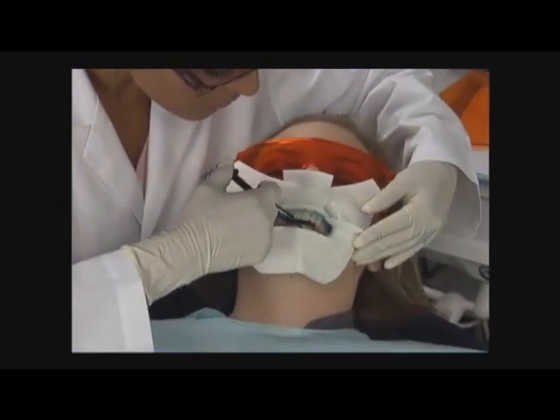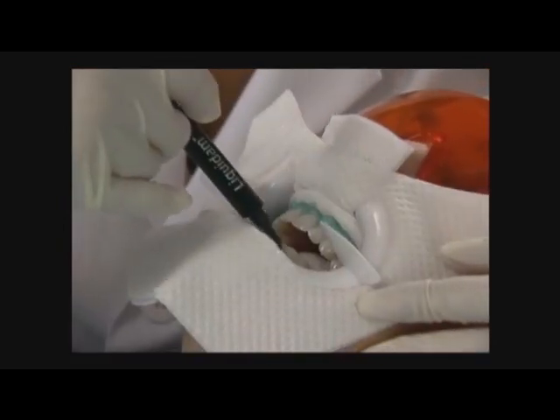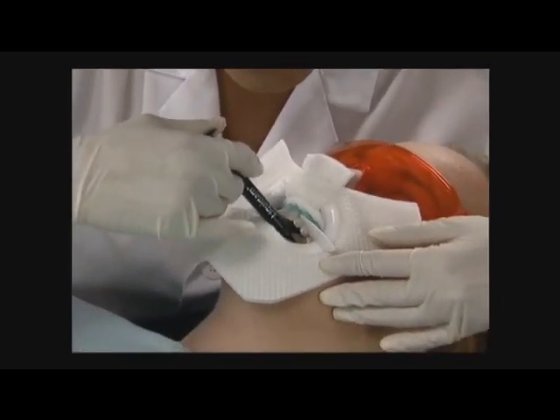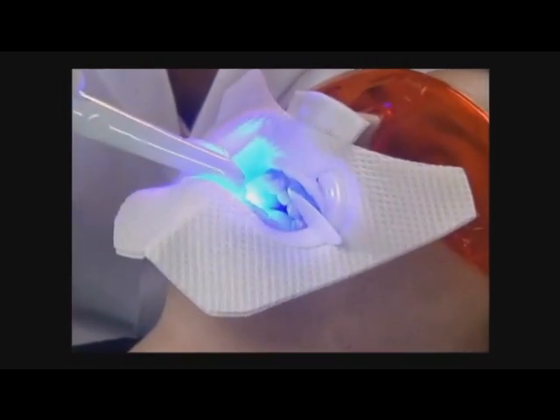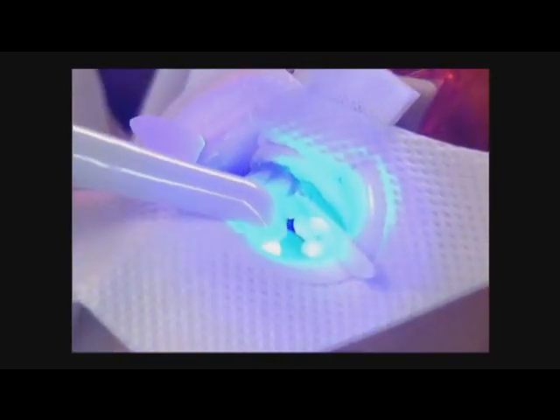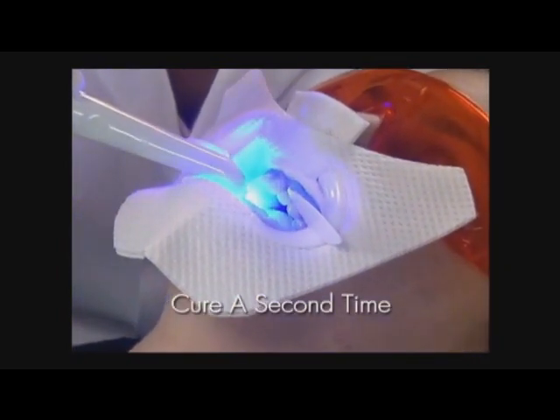On the lower arch, first apply Liquidam, scalloping the teeth at the margin to allow gravity to pull the material down towards the gauze placed in the vestibule. Again, make a second pass, sealing the isolation materials. Cure the lower arch application in a sweeping motion for 10 seconds. Once complete, use the sweeping motion again on the upper arch for 5 seconds and move back to the lower arch for an additional 5 seconds.